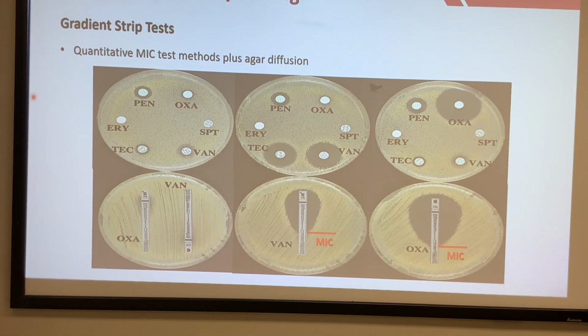So when it's equal or greater than 32, it is resistant. Right, that's an example, based on a pre-developed system. Normally the Clinical and Laboratory Standards Institute will have a pre-established standard, and all of the commercialized systems have their standard for each individual drug and individual organism. So they will have a pre-established system for you to compare with. What I gave you is just an example, okay?